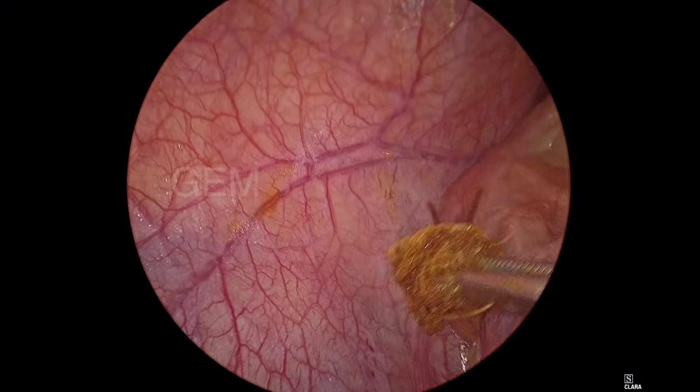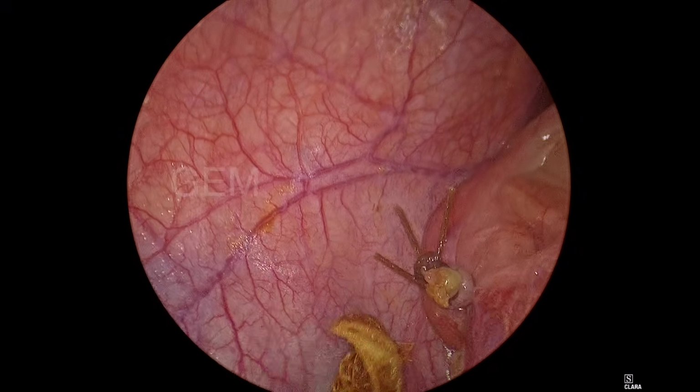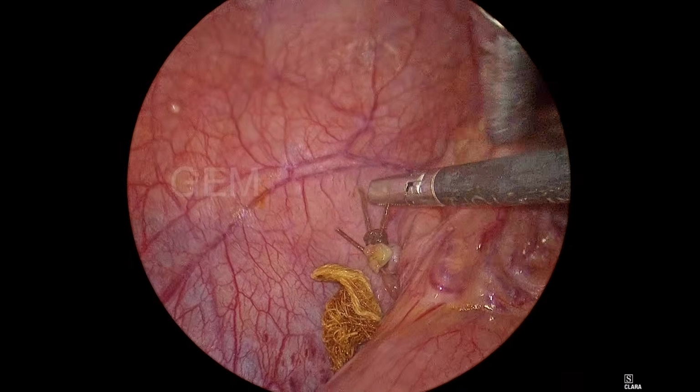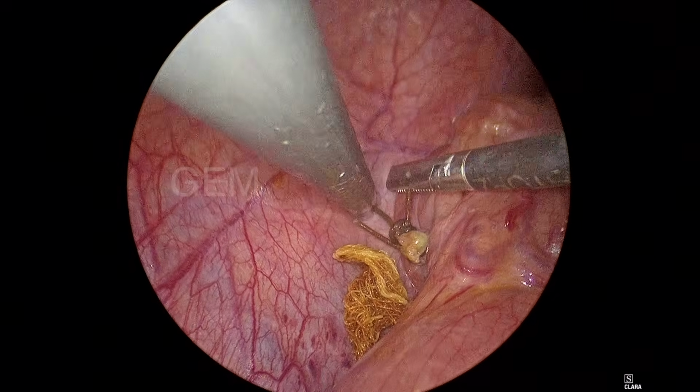So this is the betadine gauze piece applied to the base. If you feel the knot is a little bit loose, you can tighten it now.